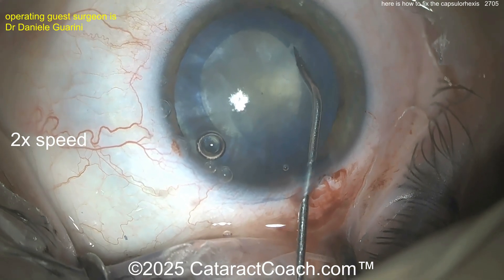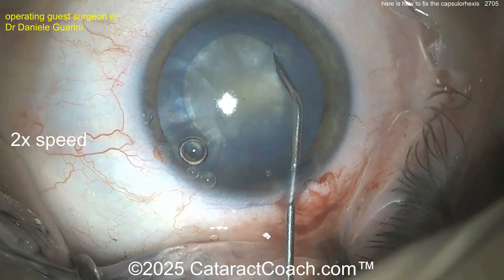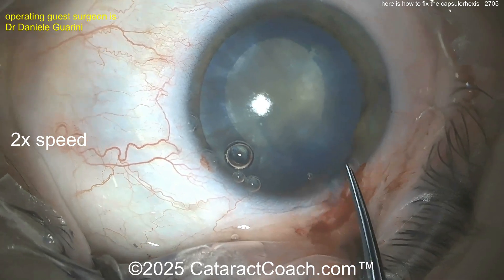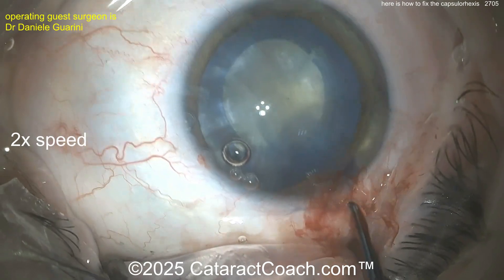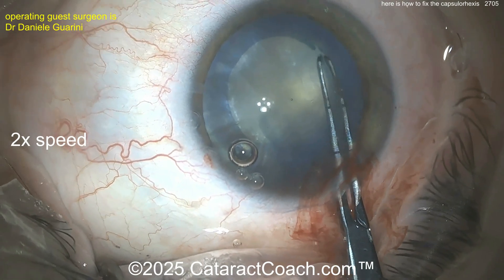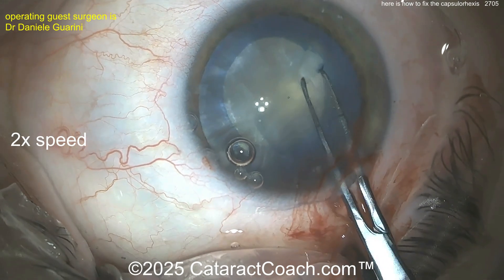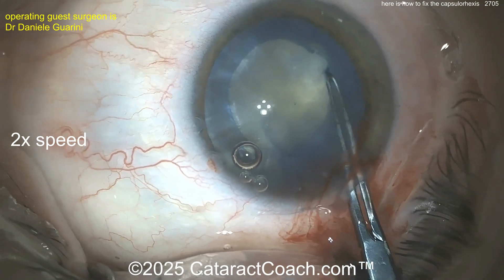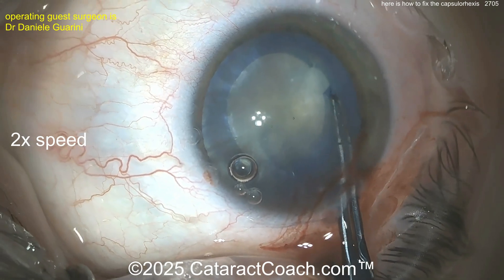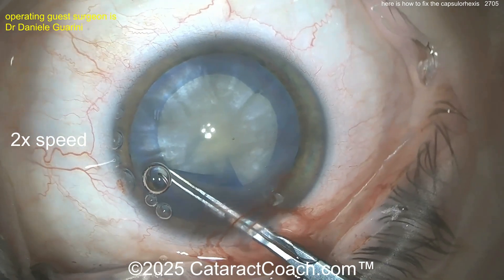Now see that tear there — you're going to be very careful because it's kind of running in both directions here. You still want to have a continuous curvilinear capsulorrhexis. You don't want to have a loose end that's going to be able to run out if you put pressure on it. Going back in with the forceps — grab that and go clockwise here. Just tear a little bit, just a little bit of a crescent, get it a little bit bigger. And you'll get a nice — there you go. Get that little strip — it's going to be a little crescent shape. Grab it, I like it. Keep it going, go around.